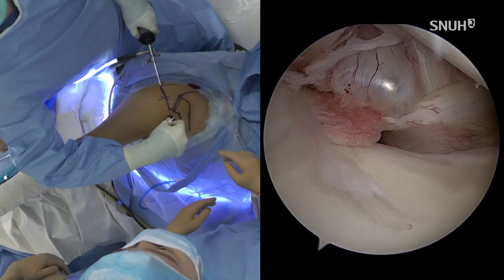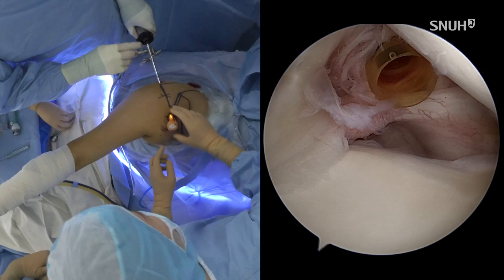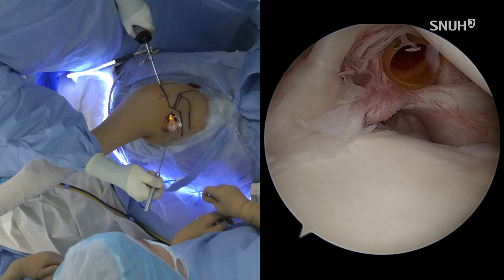A 6.5 millimeter anterior cannula was inserted. So you can see here the meniscus-looking tissue, but the type 2 SLAP lesion is here.